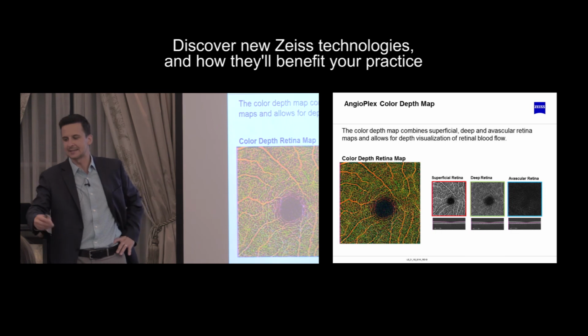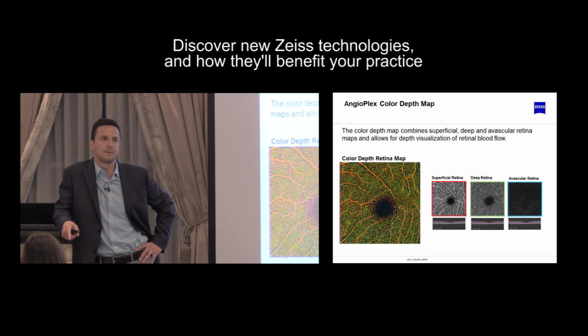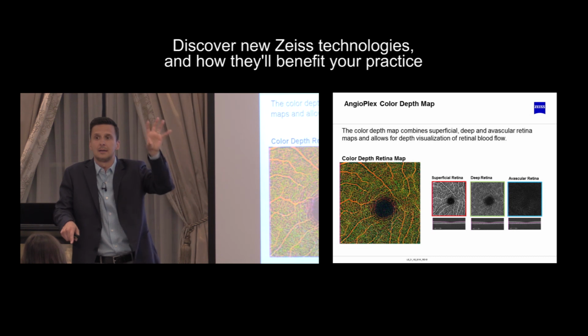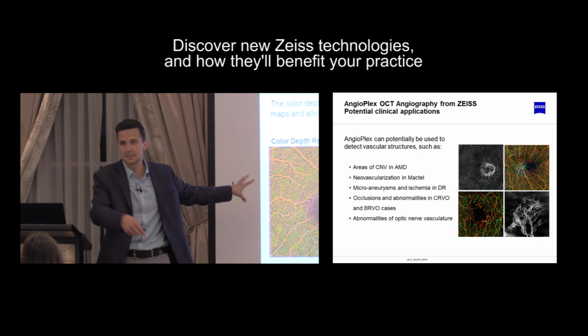No, but red disease is a condition that we refer to in the US that's based on chasing the algorithm's diagnosis, the algorithm telling you that there's a problem here in the nerve. So you look at that and you go, well, there's glaucoma. That's not an active disease. That's just meant to draw your attention that there's a differentiation from normal. And you could have other conditions which look completely normal and should be red. Realize that too. We could go into a whole course on reading OCT at deep levels. We do a lot of posterior segment in the US, so that's why I'm going there. Blue disease would be the same thing here.